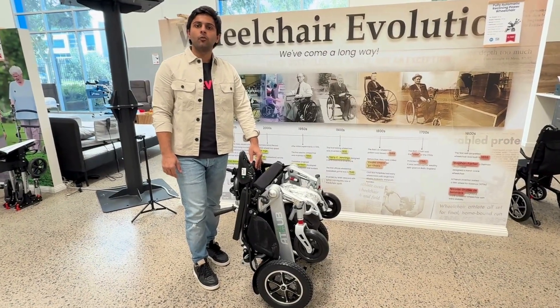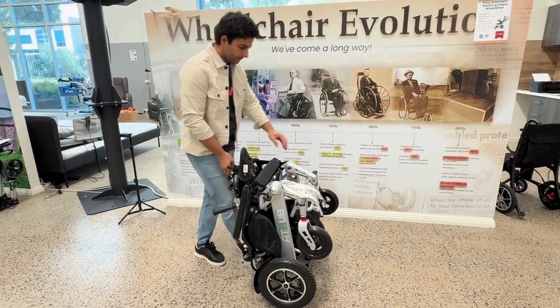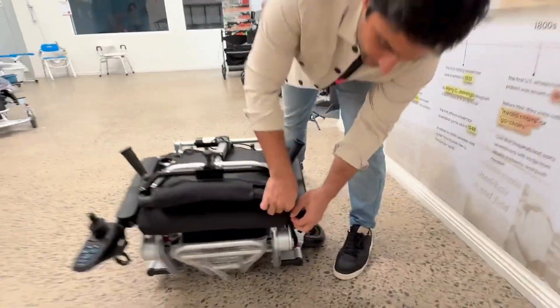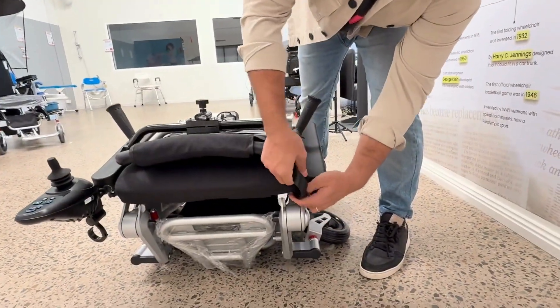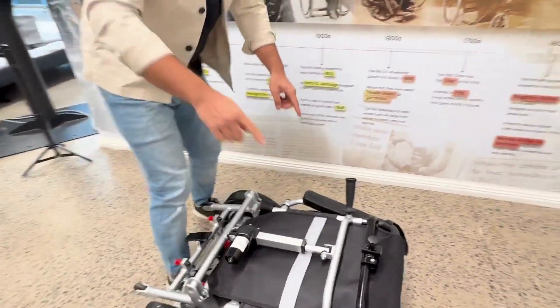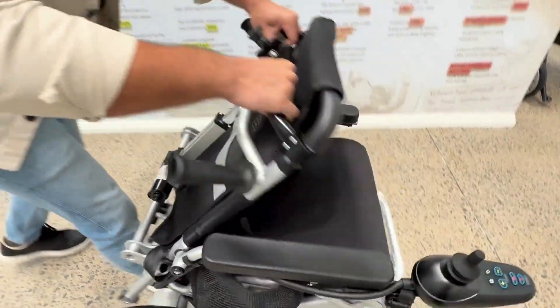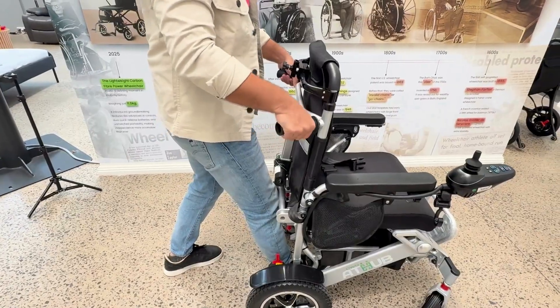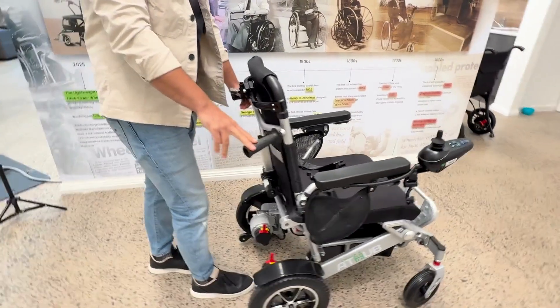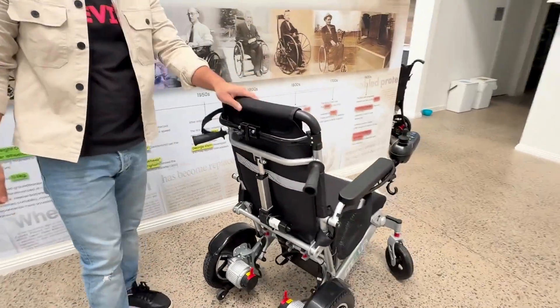Now I will show you how to unfold this wheelchair — simply lay it on its top. Now unstrap this. Using this rod, simply pull the wheelchair towards you. Then use these two handles to lock the wheelchair. Once you hear the click sound, that means the folding latch is locked. Now this wheelchair is ready to use.